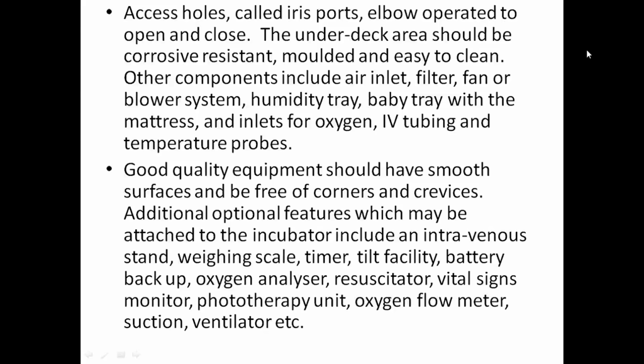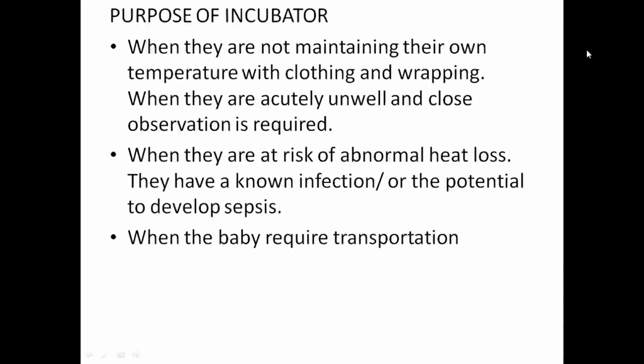Other components include air inlet, filter, fan or blower system, humidity tray, baby tray with a mattress and inlets for oxygen, IV tubing and temperature probes. A good quality equipment should have smooth surfaces and be free of corners and crevices. Additional optional features which may be attached to an incubator include an intravenous stand, weighing scale, timer, tilt facility, battery backup, oxygen analyzer, resuscitator, vital signs monitor, phototherapy unit, oxygen flow meter, suction, ventilator, etc.